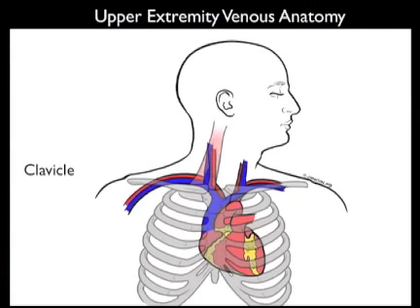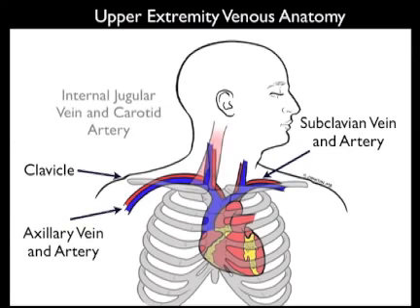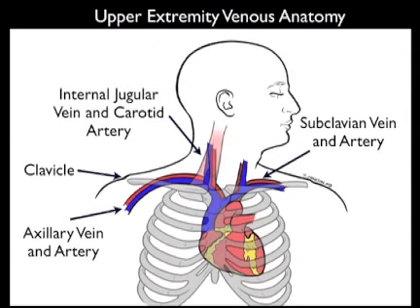Now let's review the relevant upper extremity venous anatomy that we'll need to know to perform successful cannulation of the axillary vein. Here we see the axillary vein and axillary artery lateral on the patient's chest wall. Notice here the clavicle and the first rib. As these structures move medially, past the first rib, they become the subclavian vein and artery. And we can see these arteries and veins here more medially located on the patient's chest.